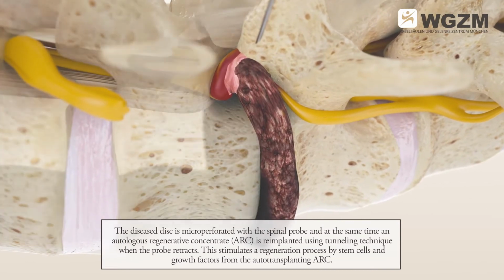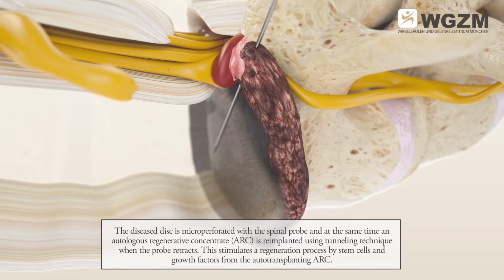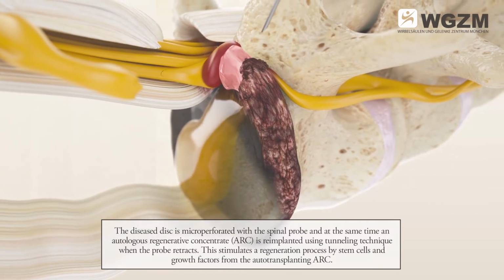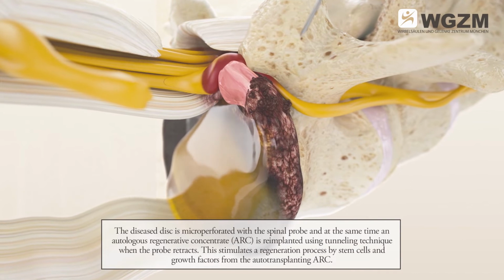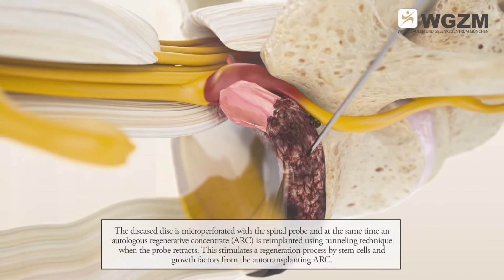The diseased disc is microperforated with the spinal probe, and at the same time, an autologous regenerative concentrate, ARC, is reimplanted, using tunneling technique, when the probe retracts. This stimulates a regeneration process by stem cells and growth factors from the autotransplanting ARC.